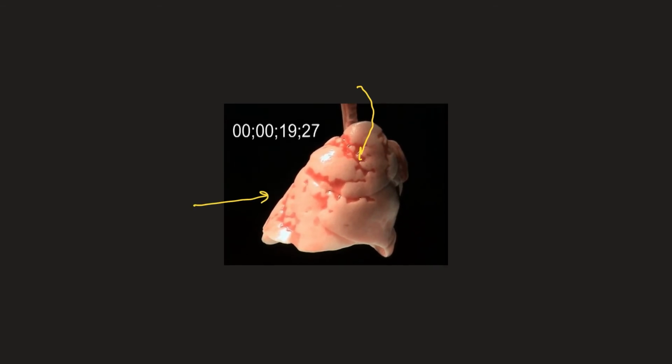All of this tells you that when you have a lot of de-recruitment, like ARDS, a lot of pulmonary edema, then you have to give time for the tidal volume to get in and give time to the alveolus to recruit. If you give a short inspiratory time, you will not allow this. See, 40 seconds here. I'm not saying spend 40 seconds in the inspiration, but that tells you that you have to spend adequate time in inspiration.